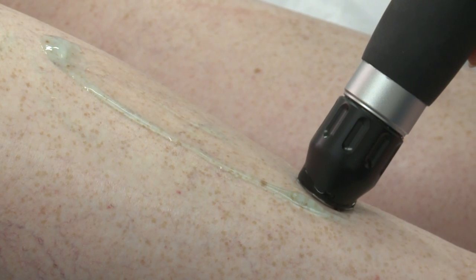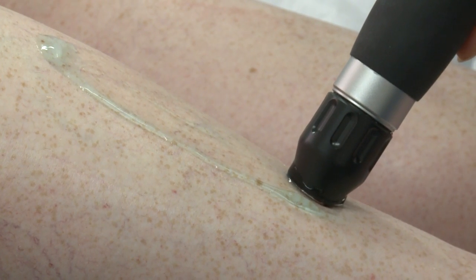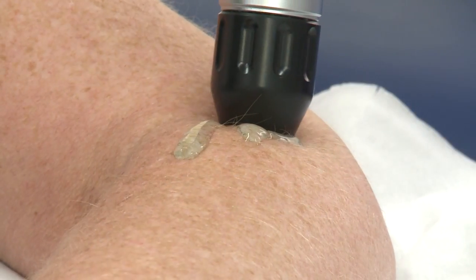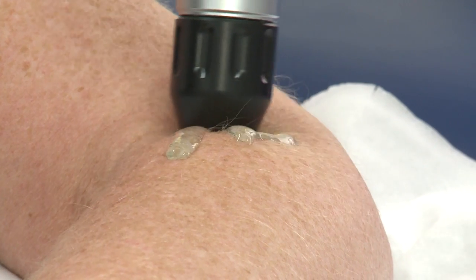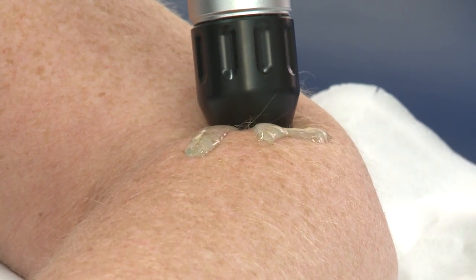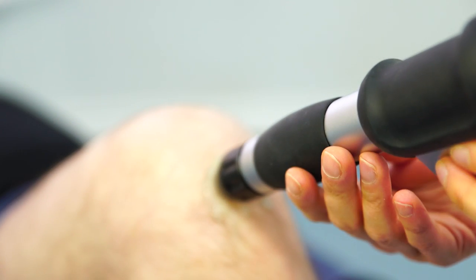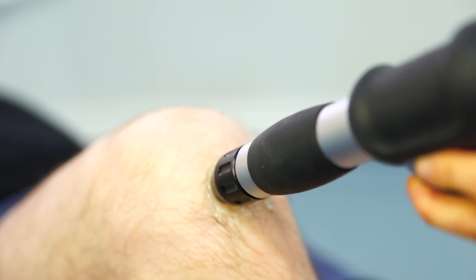During an extracorporeal shockwave therapy session, high energy sound waves are created and focused on the injury site using a special pad. Shock waves are repeatedly applied to the injured area to break down any scar tissue and or calcifications in the area, which in some cases the body is unable to repair itself.